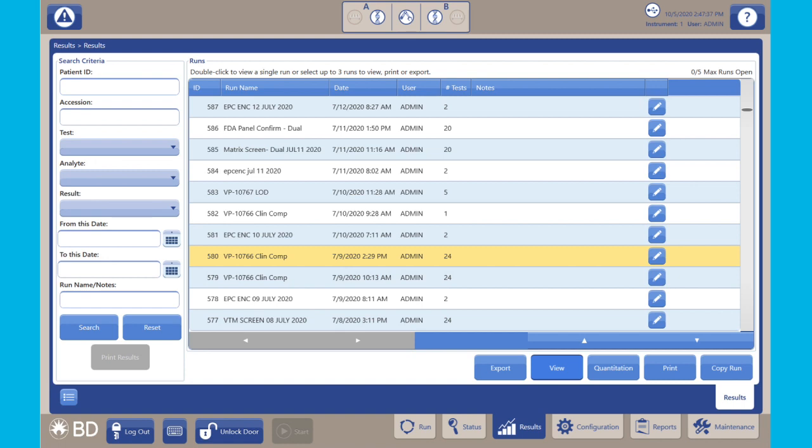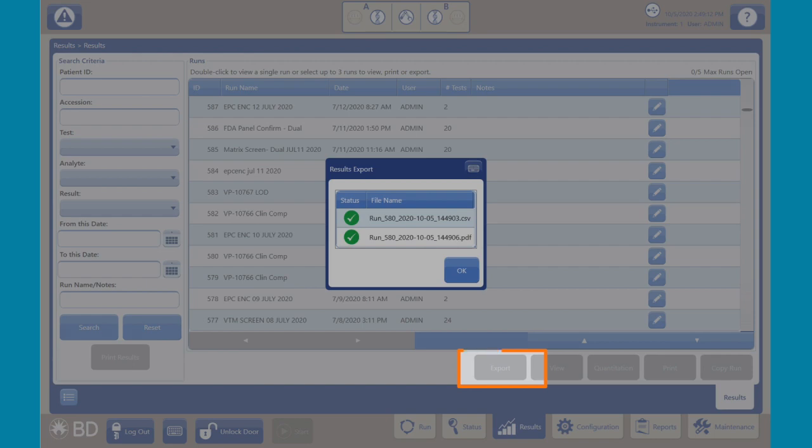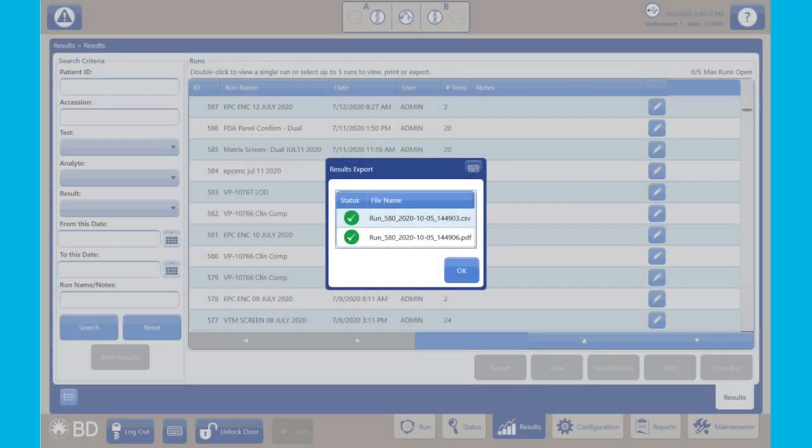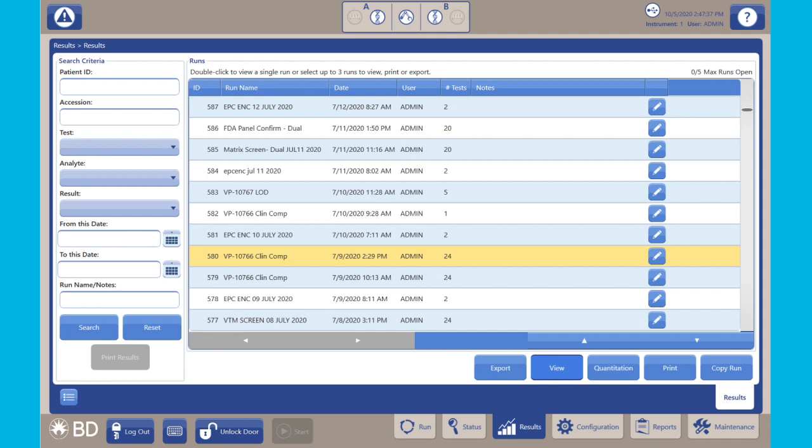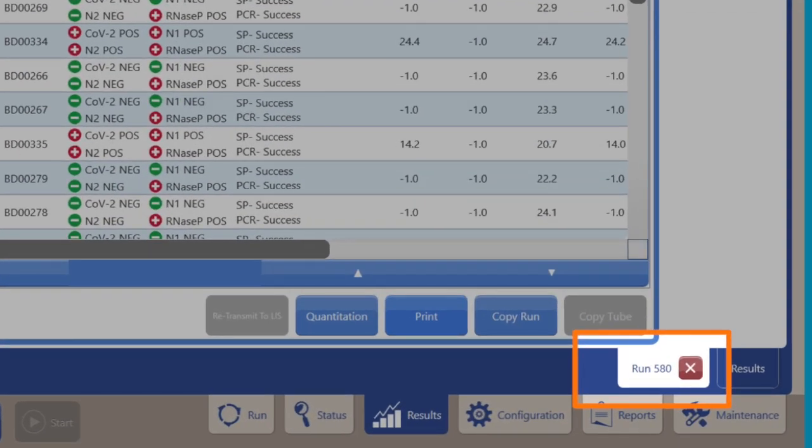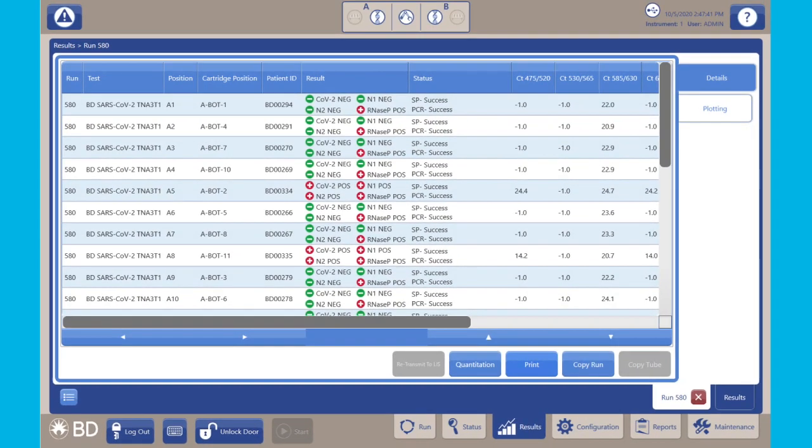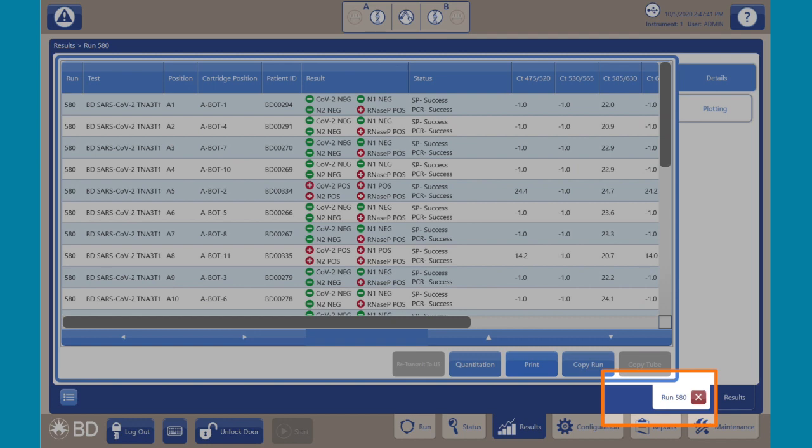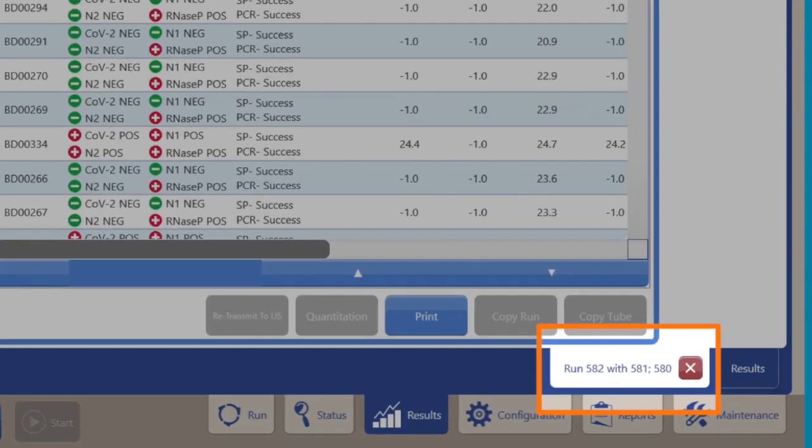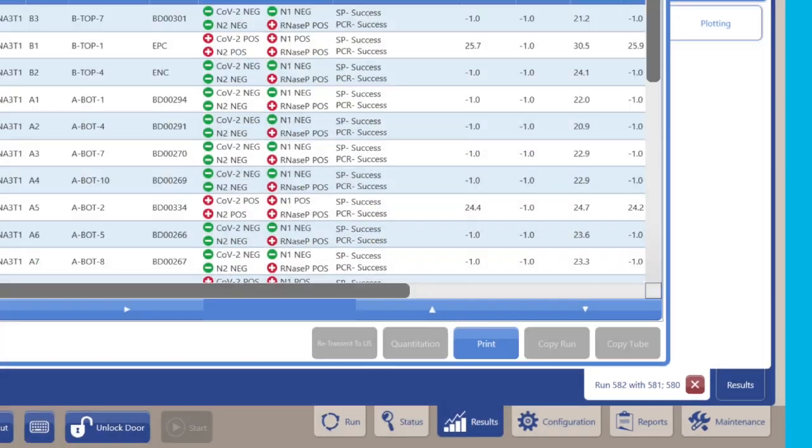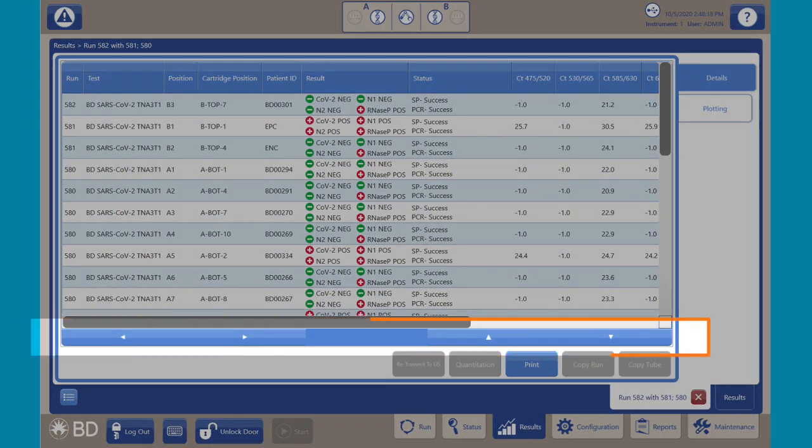When a run is selected, you can perform a variety of actions. The export operation exports results to a CSV file and copies a PDF file of the current run report. To view run results, double-click the desired run on the list display. A new button appears above the menu bar, labeled with the run number. For example, run X, where X signifies the run number. You can also open two or three runs in the same run window. Click the run button to open the run details display. You can open multiple run details displays and scroll through the list with the navigation buttons at the bottom left of the display.